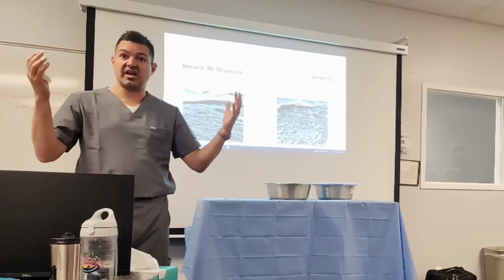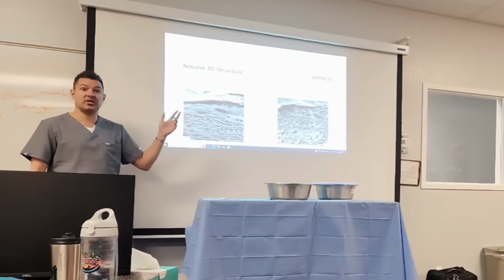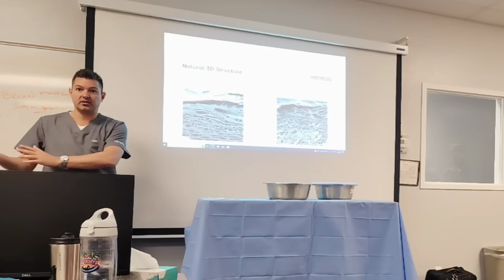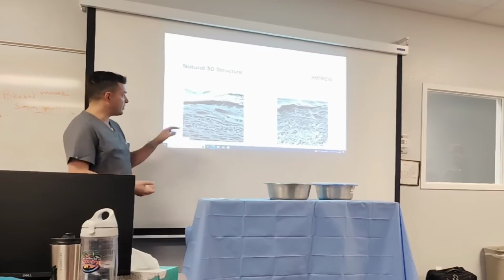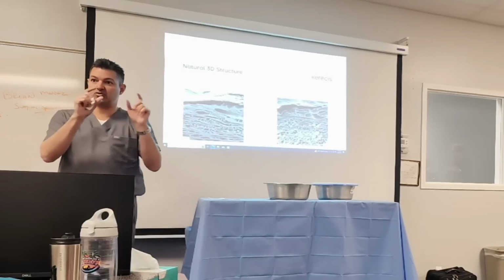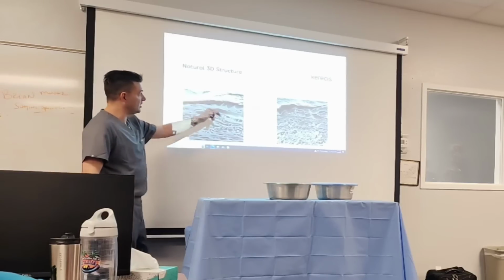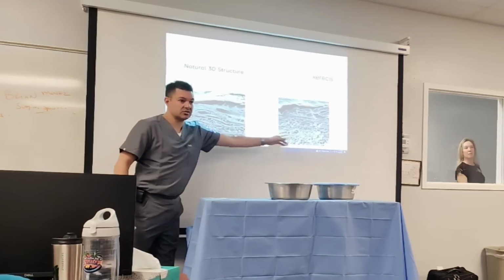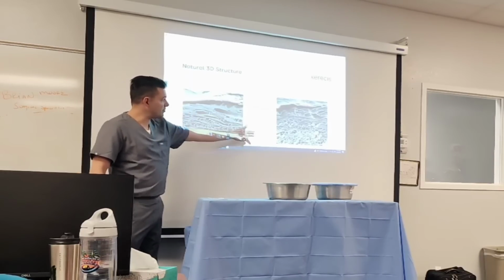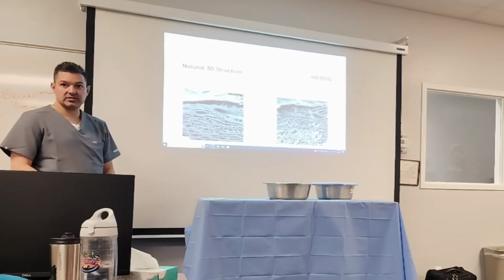achieve like with like. So this particular slide really demonstrates the similarities when I say that it's very homologous to human, I'm talking about the structure in itself. So it's structures that are very similar with like structures. This is the fish skin, this is the human skin. You can see how very similar they are, and we're able to have our epidermis and the dermis in these skins. Next slide.